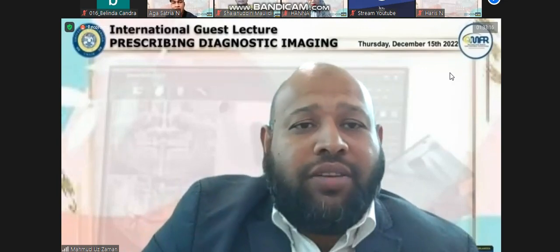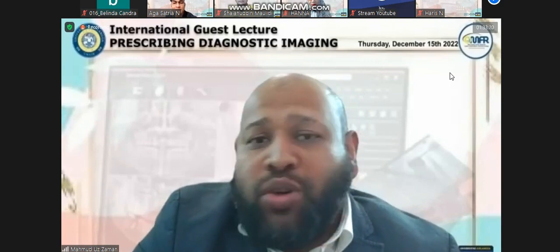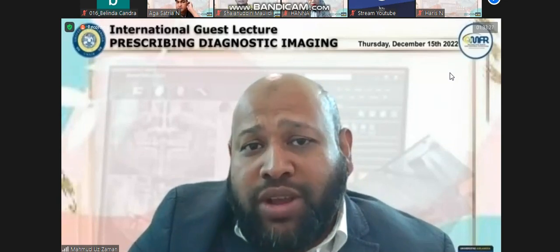In the panoramic radiograph, you will only see the bony changes. You will not see the disc or soft tissue if there is any disc dislocation.